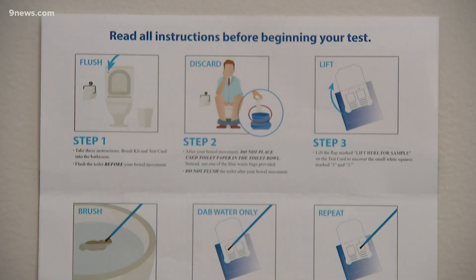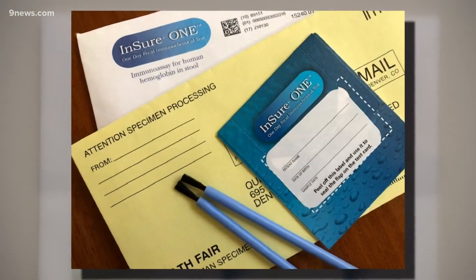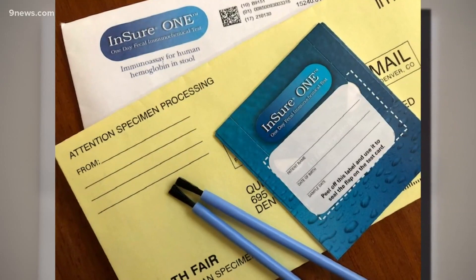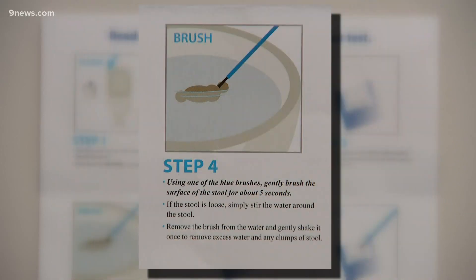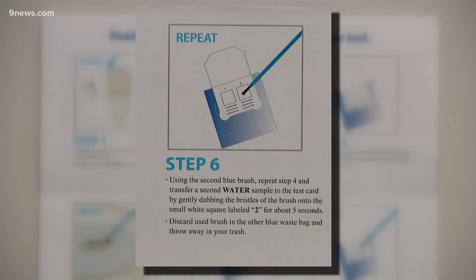It does come with instructions, but I'll walk you through it. You go into the bathroom, you do a number two. You take this test card and these two brushes. You wipe the stool with the brush for five seconds with one brush, then swab the card. Repeat one more time with the second brush.